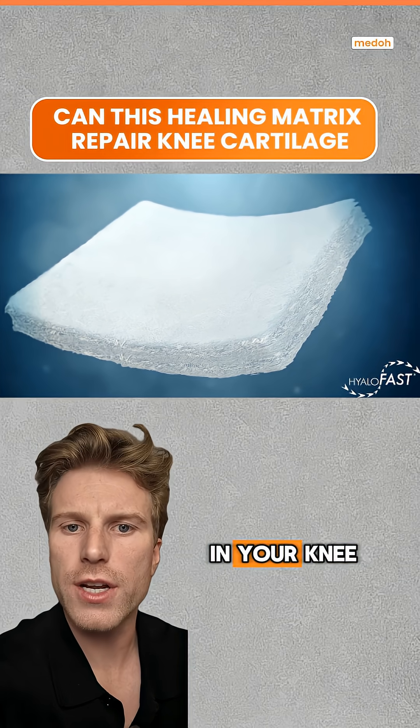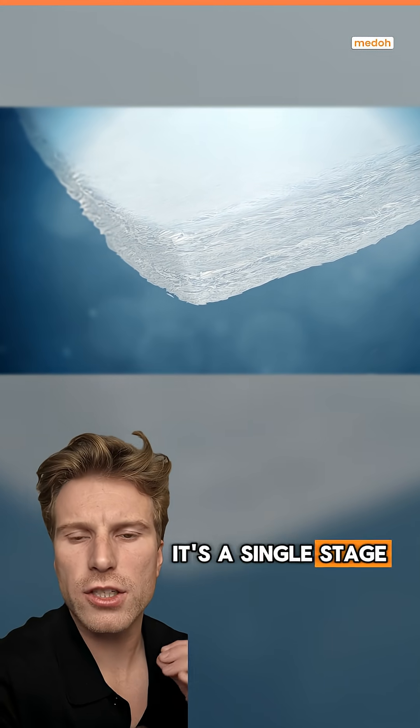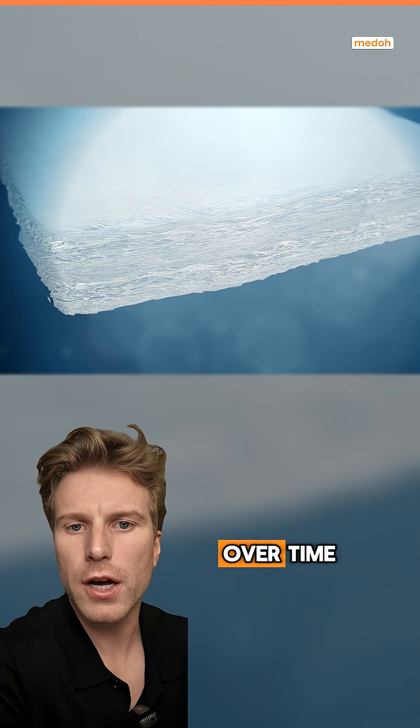So how does this 3D scaffold help cells in your knee repair damaged cartilage? This is Hyalofast. It's a single-stage cartilage repair matrix that is designed to create the ideal healing environment for cells to migrate into and heal damaged cartilage over time.